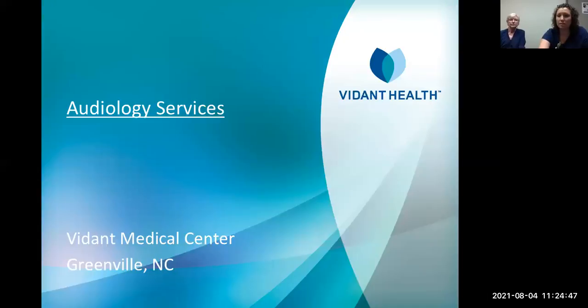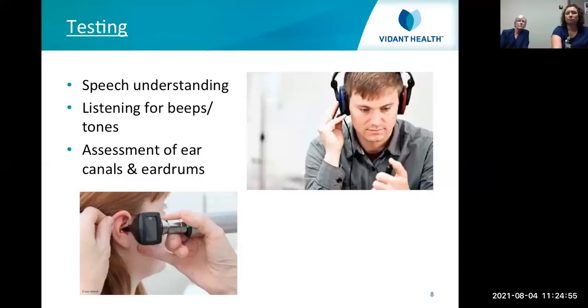All right, so Ms. Sandra is going to talk a little bit about the services that we offer here at the audiology department at Vidant. Okay, so the first thing when you come in for a hearing test, we're going to be asking you some questions to see how long you've had the hearing loss, if there's been any recent change, things like that.